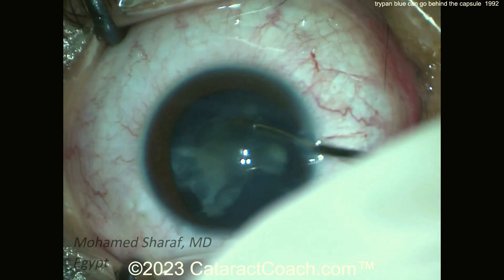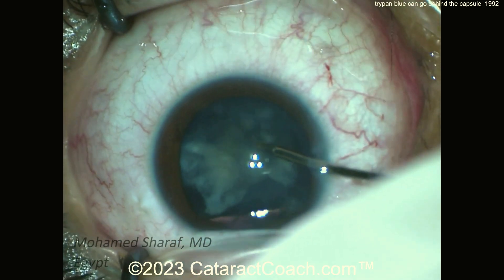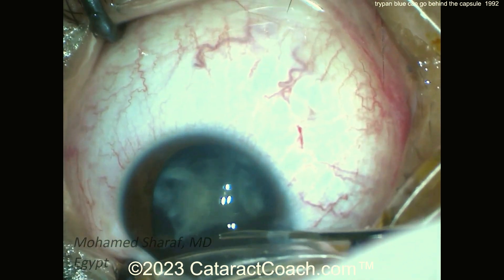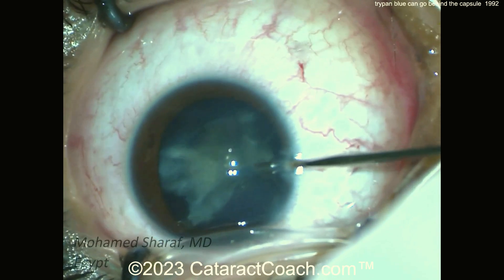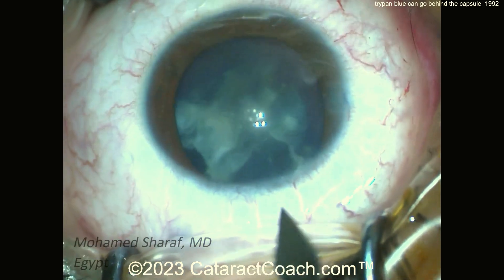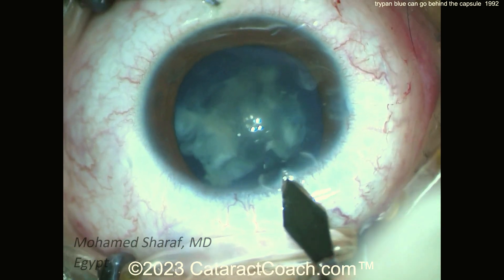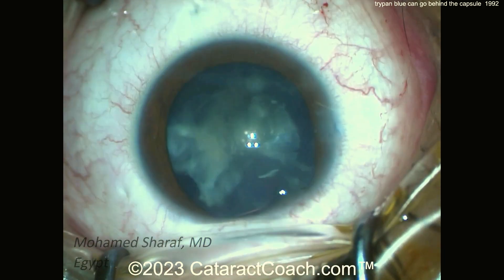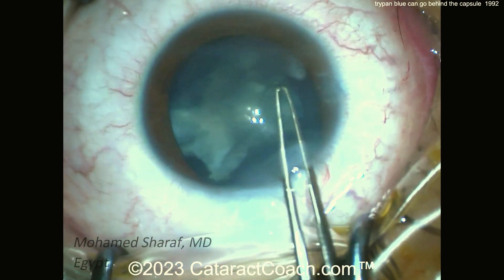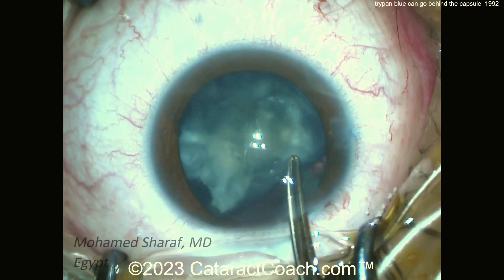That looks pretty good. Not a real dense lens — it's going to be relatively easy to just aspirate. I'm watching the video for the first time with you, but I want to emphasize this point: we've had multiple video submissions from surgeons around the world showing that in certain cases, you can get trypan blue dye going behind the lens and into the vitreous, causing you to lose your view.